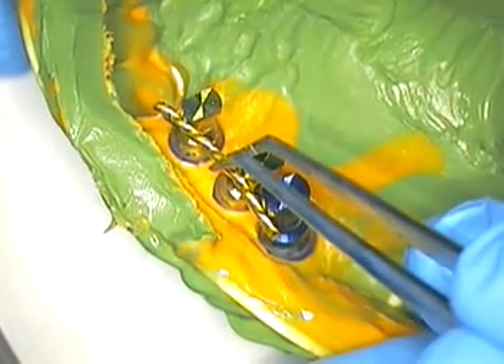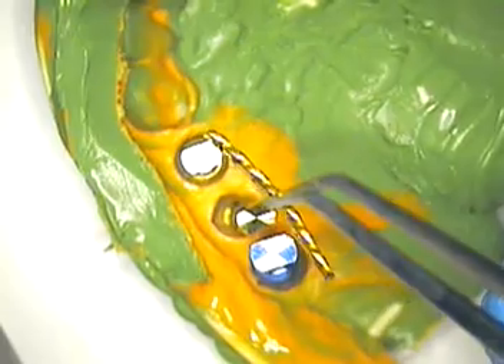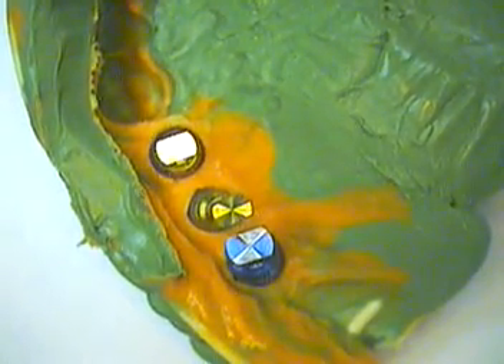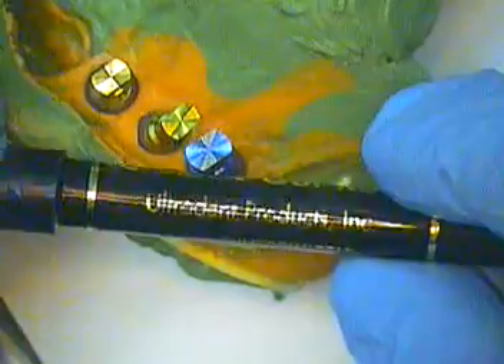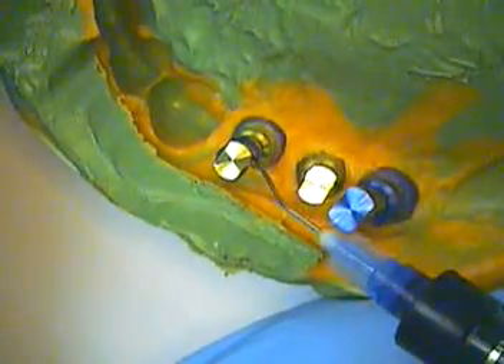Once you've got it cut properly — I like to cut it so it's just a little bit further extended past the end implant — I'm going to add the composite resin. This is a very nice material to use. Here's our resin, and I'll go ahead and add it. I just use a syringe tip — the tips I get with the acid etch gels, and that seems to work pretty well. This material is called Ultradent Light Cure Blockout Resin. I did have to lower the light for this, so we'll add it to the buccal, make life easy, and it really sticks well to anything. We'll make sure we wrap it all the way around to the other side, just so it doesn't slip off while the model's being vibrated.